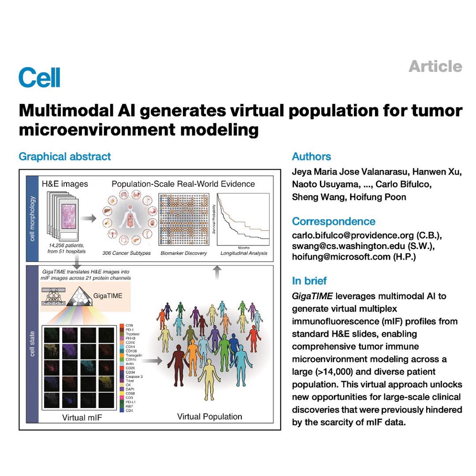Okay, another quick check. The virtual atlas confirmed knowns like TMB and immune activity, but also found key nuances like the immune exclusion in KRAS tumors and the TMB exception in LUSC. And that the multiplexed 21 protein signature is essential for robust survival prediction. We've established all this clinical relevance from counts and densities, but GigaTIME gives you images, these rich visual maps. How can the AI use the organization of those proteins to find even deeper insights?